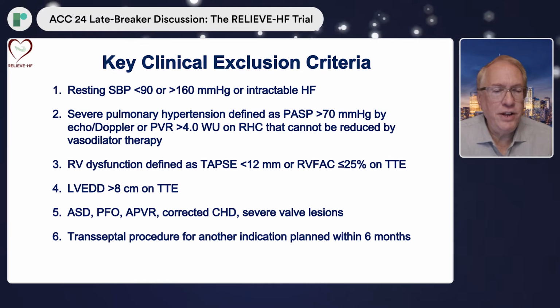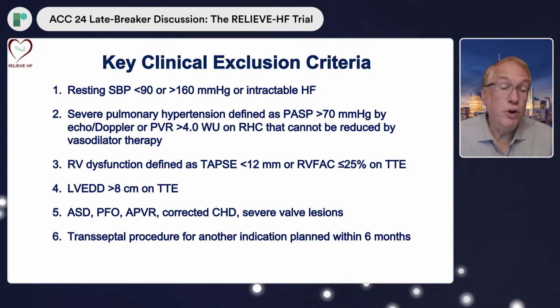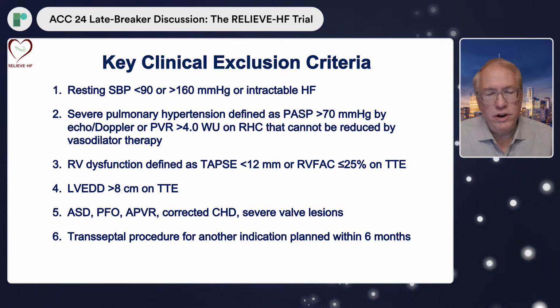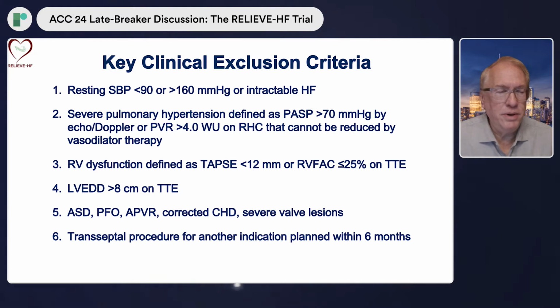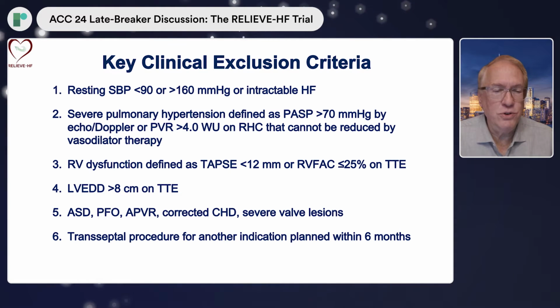And what were your key exclusion criteria? So there were a number of exclusion criteria, such as an abnormality of the interatrial septum, if there was moderate or marked right ventricular dysfunction or pulmonary hypertension. You alluded to that in the past. Prior coronary bypass graft surgery, and life expectancy less than 1 year for non-heart failure related reasons, and a variety of exclusions such as that, need for chronic oral anticoagulation, etc.